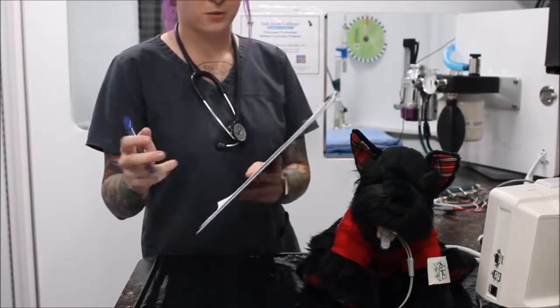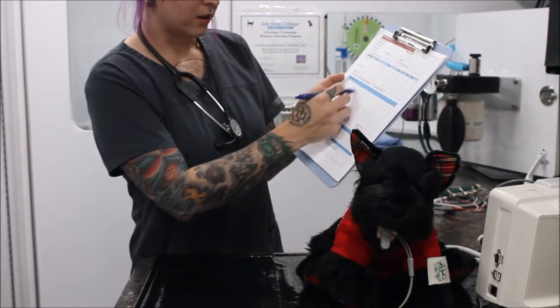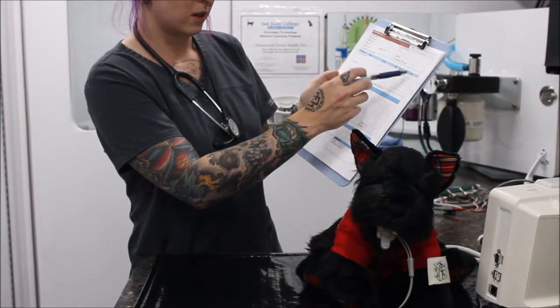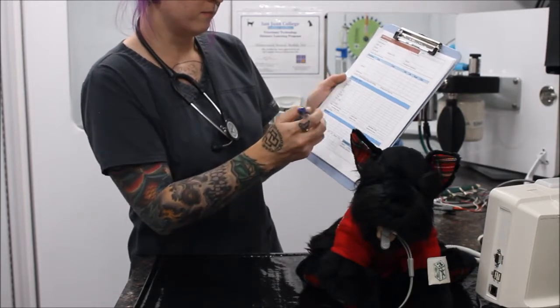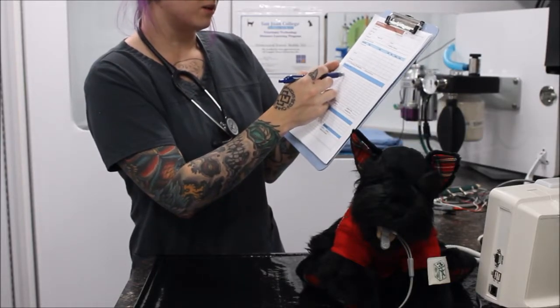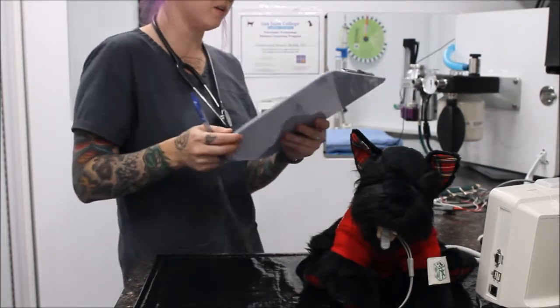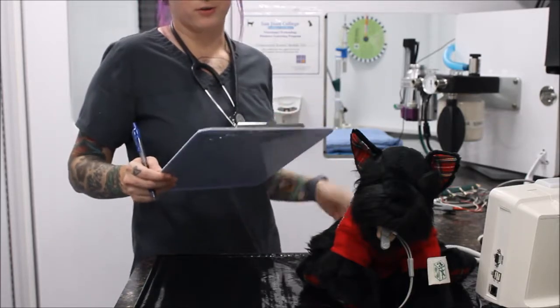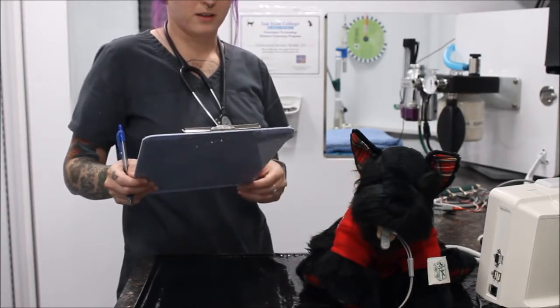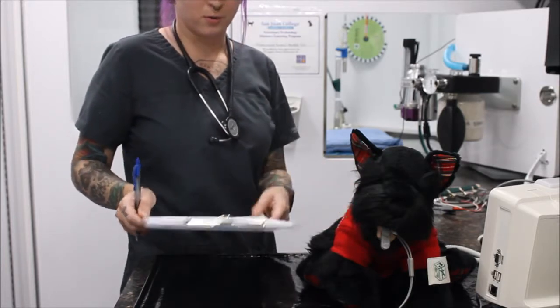minutes. And then we have our anesthetic form here. We record everything on here about every 5 minutes. We record all the medications that were used, the dose, the route, and the time that it was given. We also record recovery time on here. So we monitor heart rate, mucous membrane, CRT, blood pressure, respiratory rate, and tidal carbon dioxide from our capnograph, as well as SpO2. We monitor the fluid volume that our patient is getting, temperature and thermal support, and we always monitor the percentage of ISO given during surgery and the oxygen flow rate as well.